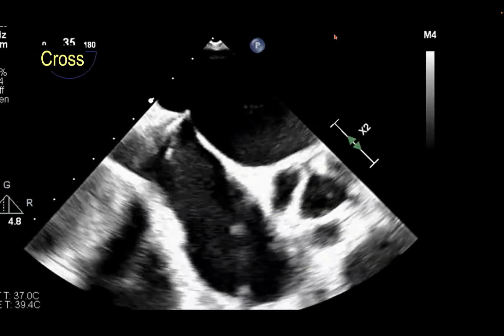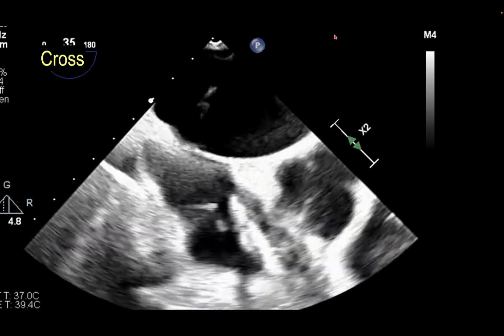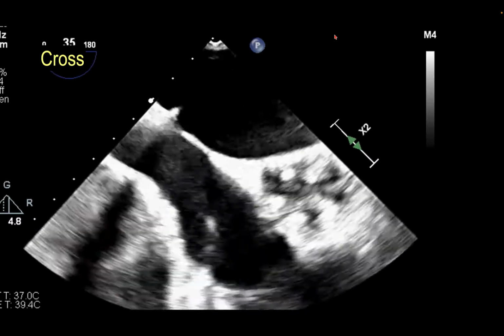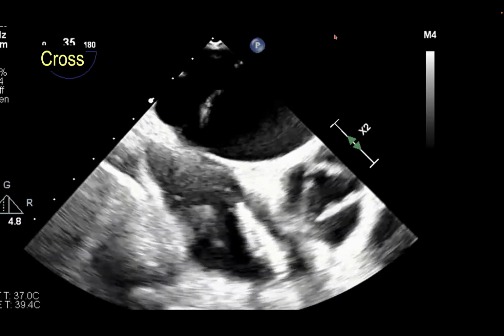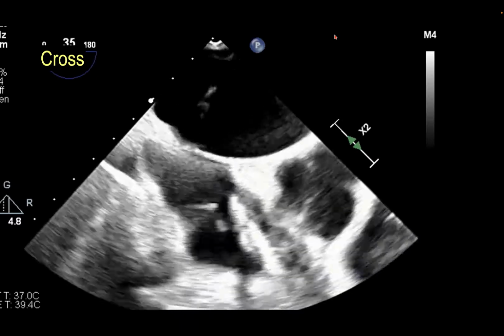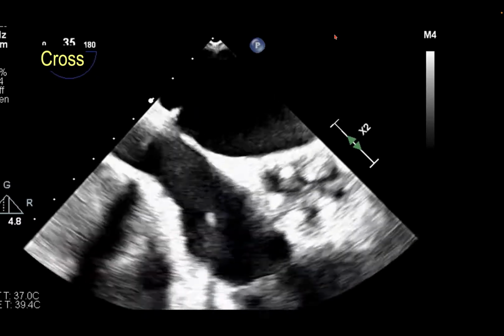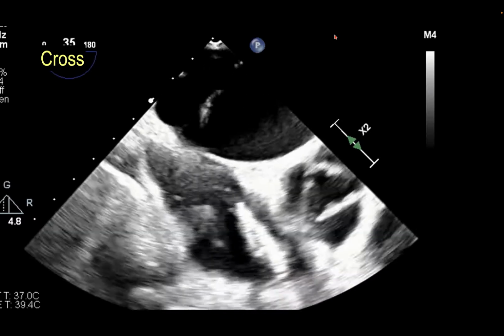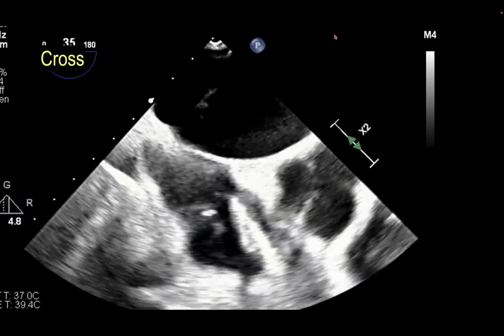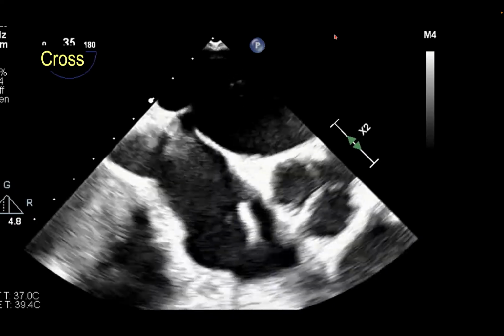And now this is the last stage, which is done in real time, and that's when the needle crosses. We wanted for this specific case the puncture to be rather posterior and rather inferior. When we go over the case, we'll go over why we did this, but this was pre-planned and not an erroneous puncture of this needle. So this again demonstrates that it is important to have a complete huddle before you do a transseptal puncture, to discuss exactly what you're going to do, what the challenges are, and how we're going to resolve those challenges. Great. Thank you. Great.